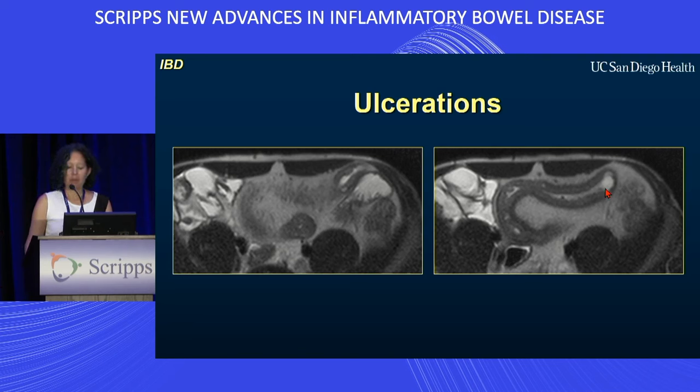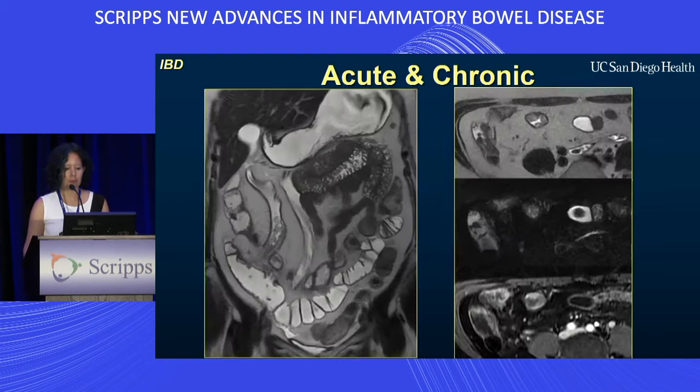This sometimes can be a relatively subtle finding from the radiologist's standpoint, looking for that inner layer of mural irregularity. We've been notoriously, I think, undercalling ulcerations on imaging. And I think, hopefully, as radiologists become more and more comfortable and more rigorous in their evaluations of the examinations, we'll have increasing sensitivity for these.